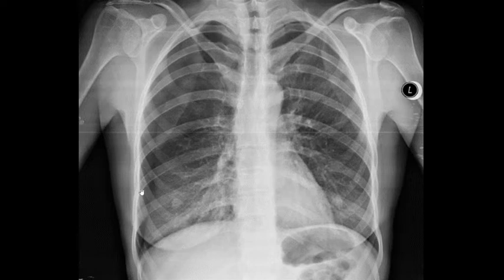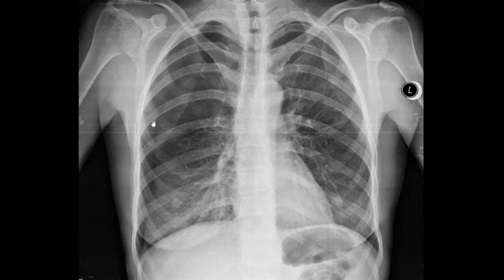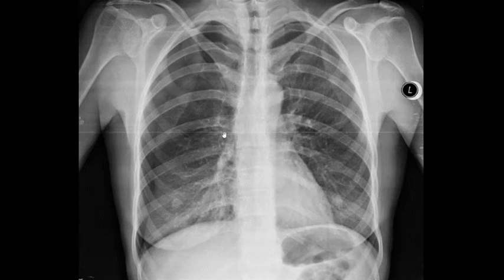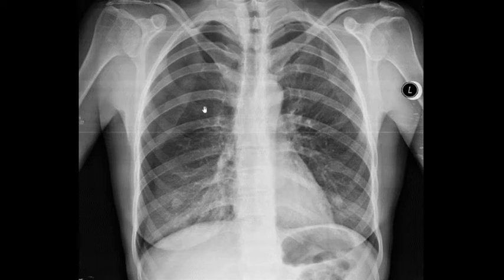All the dark area here is air, and this air has pushed the visceral pleura away from the parietal pleura. There is no vascular lung markings on this side, we can see the line of the visceral pleura, and there is obvious asymmetry between the two sides. This is a clear-cut pneumothorax — after seeing five or so of these, you will always easily identify them.